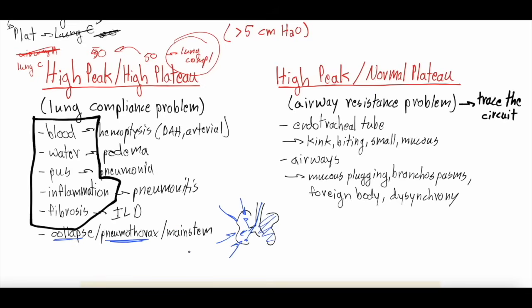Or if you have a pneumothorax, a popped lung, let's say this lung's totally collapsed because there's a pneumothorax. Again, you're just ventilating one lung. And the amount of tidal volume is the amount of tidal volume, right? Let's say you set the tidal volume at 500. That tidal volume is supposed to go into both of the lungs, right?